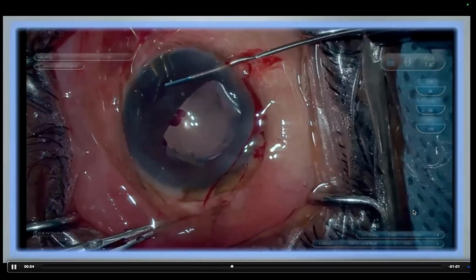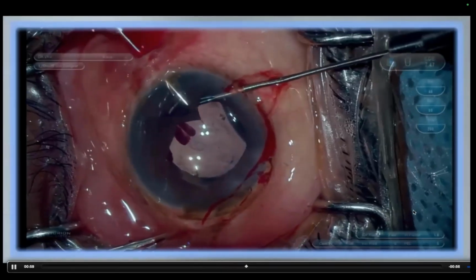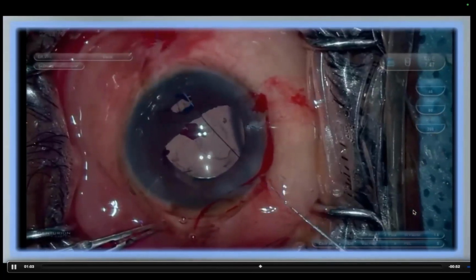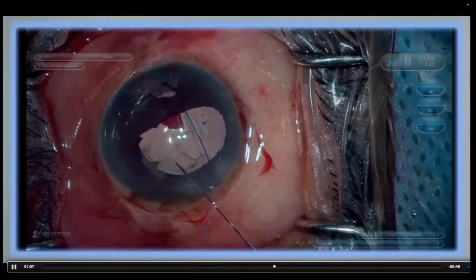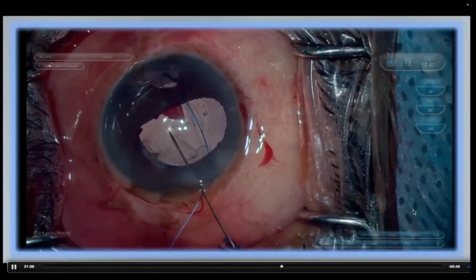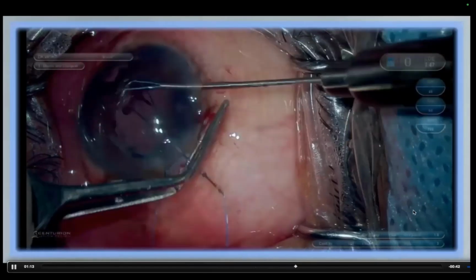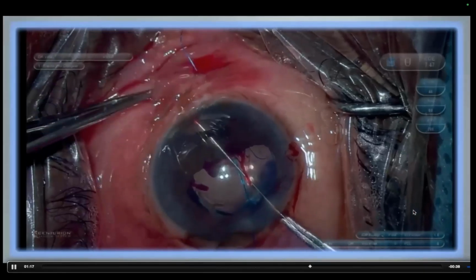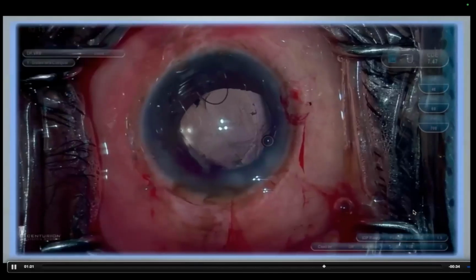The peripheral iris is held using the same needle. A puncture is done, and then the needle is exteriorized through the outside. You don't cut the needle; you reintroduce the same needle through the paracentesis, and then the peripheral iris is punctured. Once it's punctured, parallel to the iris plane, a sclerotomy is done, and then it is brought out. Now you have a loop inside.